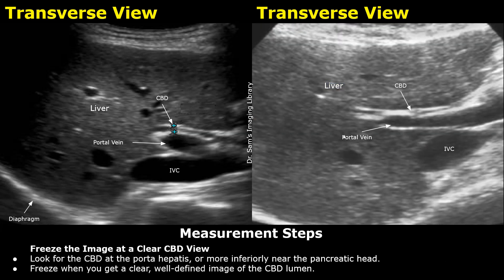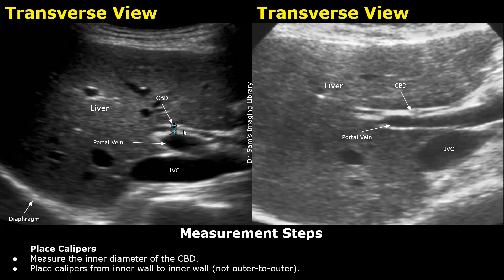Once you get a good view of the common bile duct, freeze the image. Now you can proceed with its measurement. We measure the inner diameter of the common bile duct, so place both calipers at the inner parts of the hyperechoic walls in this manner. Do not place the calipers outside the hyperechoic walls.